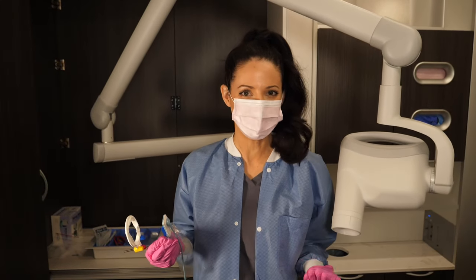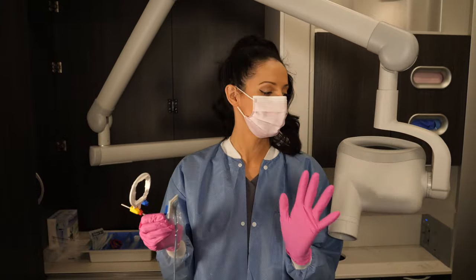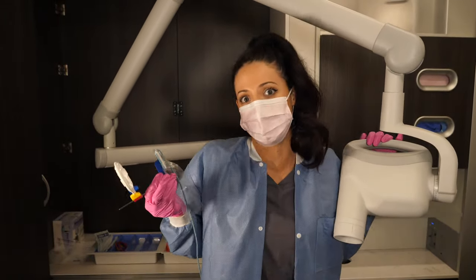Hi everyone, my name is Whitney and I'm a dental hygienist. If you're new here, welcome. If you've been here before, welcome back. Today we're going to talk about how to take good x-rays.